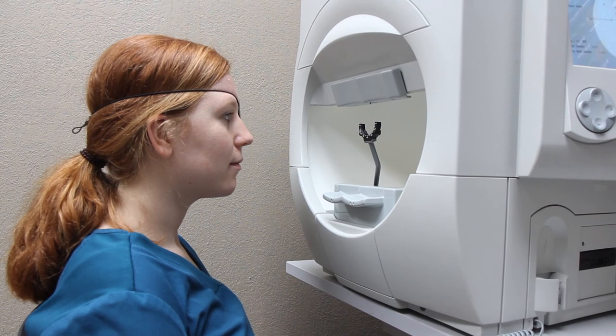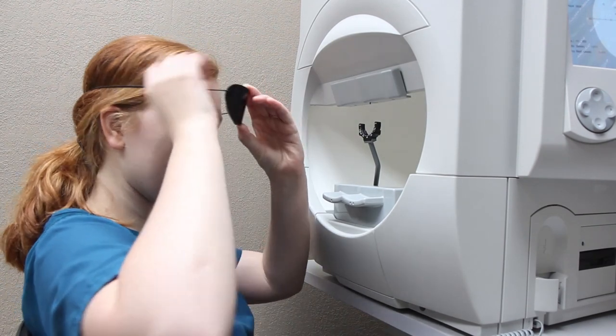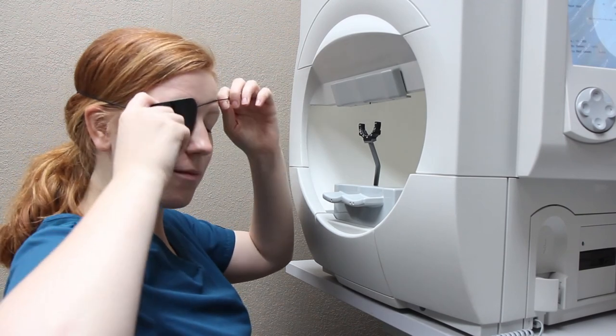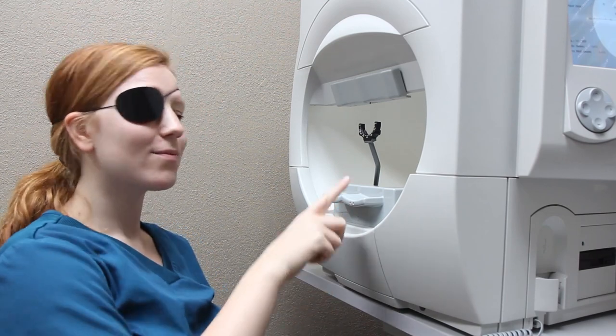You may rest in between testing each eye while the computer saves your results. Then the technician will tell you to switch the patch to the other eye. Put your chin on the right side and your forehead against the bar to test the left eye.